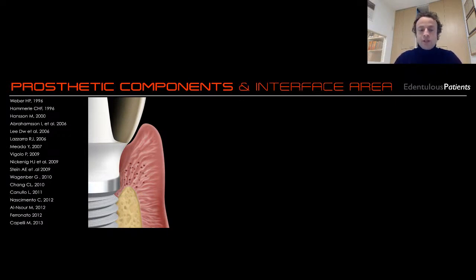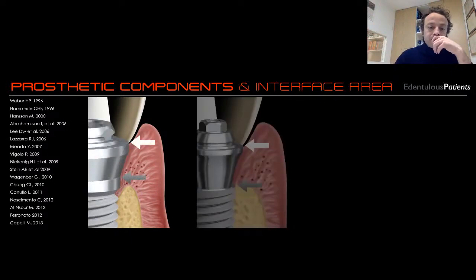And unfortunately, the patient then needs to come to the clinic when probably the patient still has swelling and pain. And so managing the patient in this situation is not comfortable for me. So honestly, this approach is not really my technique. And as I have already said to you, I like to use the denture a lot, or I like to create a temporary restoration using a guided approach, using a digital workflow where I can get a preliminary model from the surgical guide.